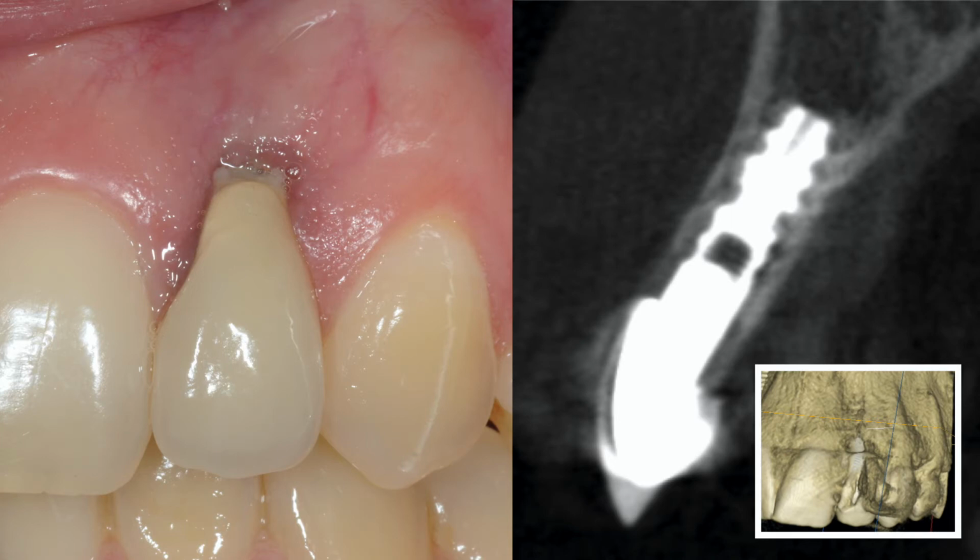And incidentally, we see that there's actually good alveolar bone. It seems like the implant was placed very nicely within the envelope of the alveolar bone. Very nicely for a surgeon, but maybe not so nicely for the restorative dentist. Right. And that's why the two of us are sitting here as the team.